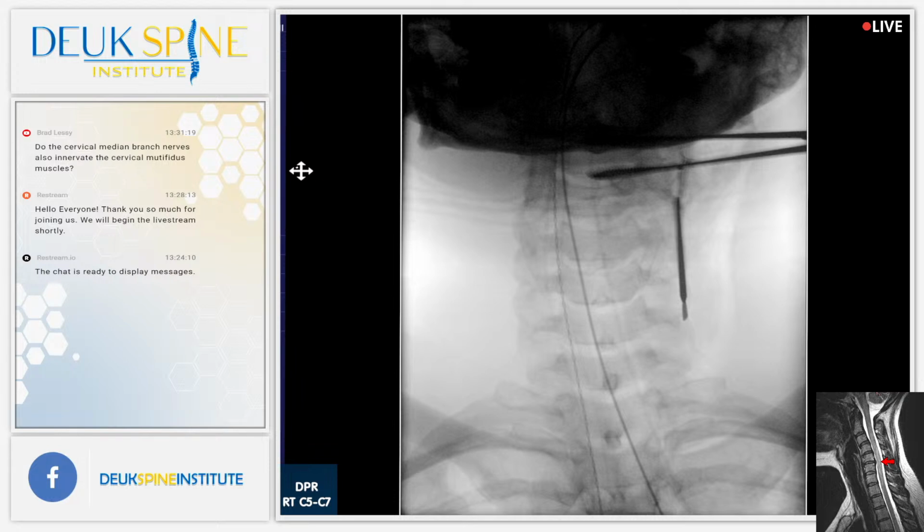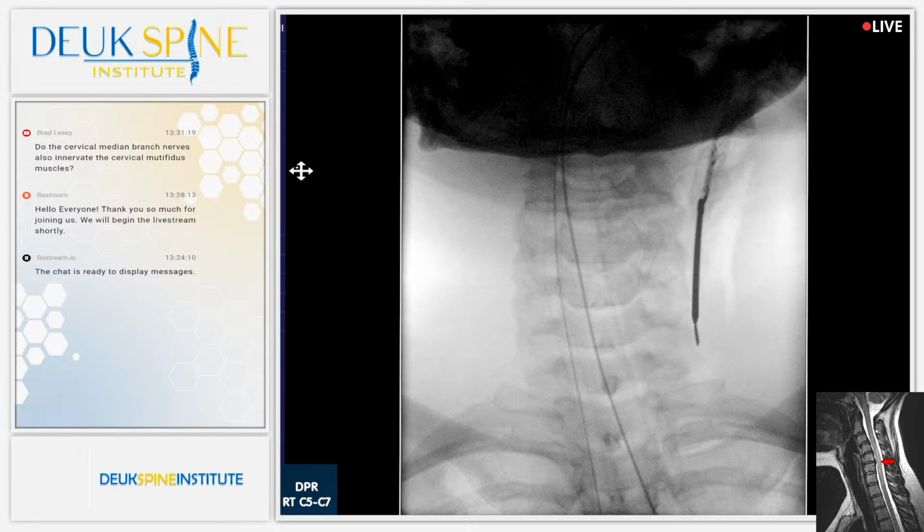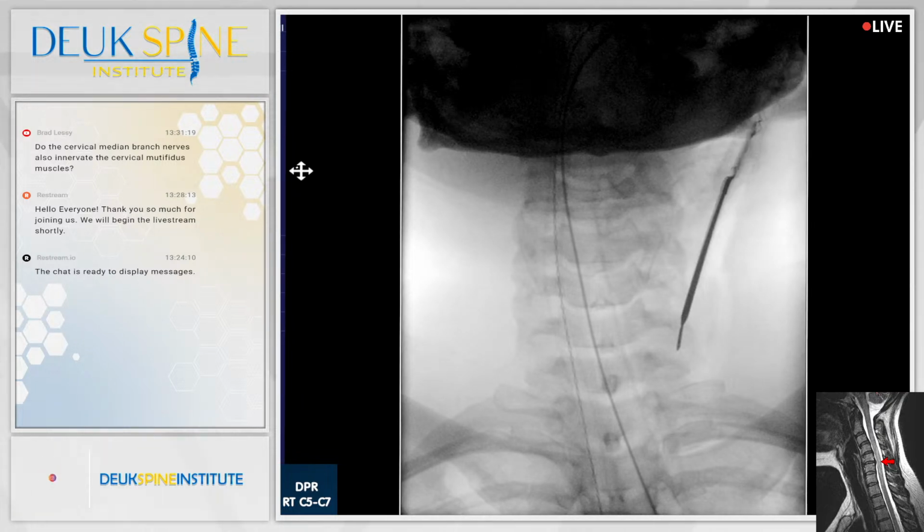Just have one more to go and we're done. Shot? All right, it's looking good. Just about there. Shot? Any other questions? At this moment, no current questions. Wonderful. So we're pretty much done here.